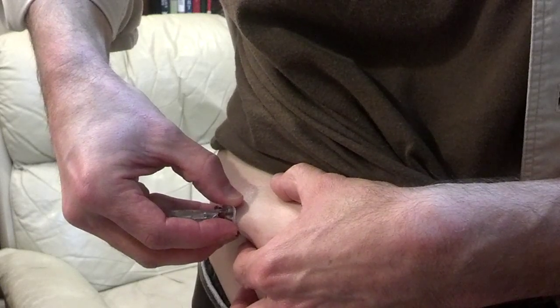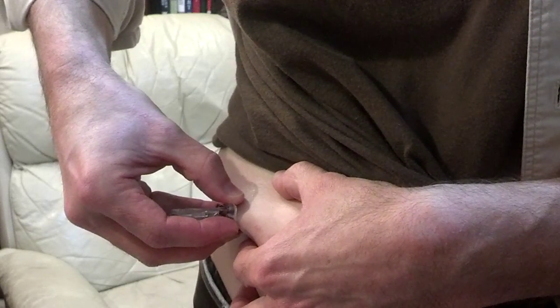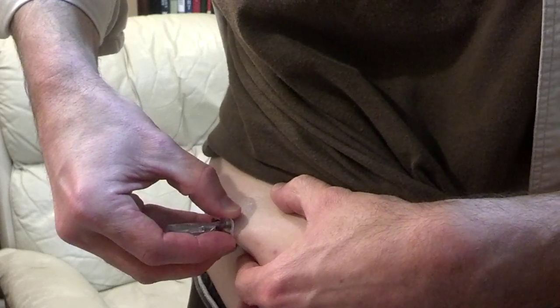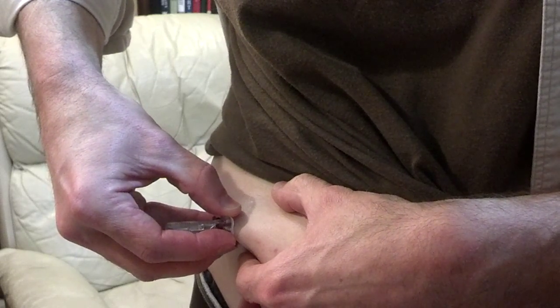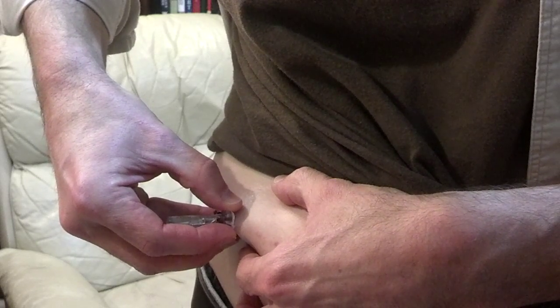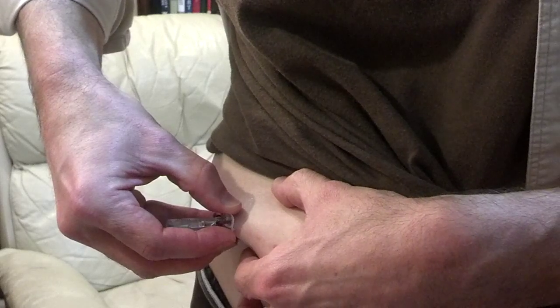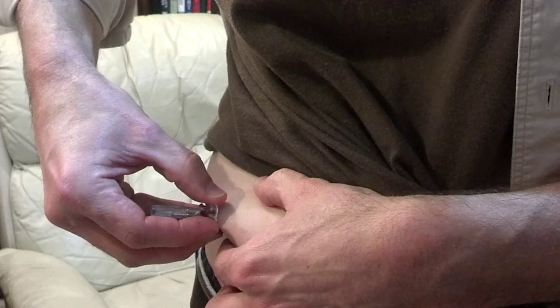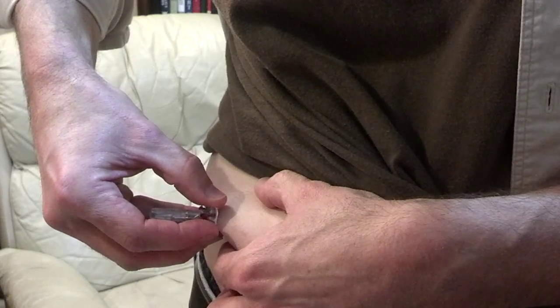It's not letting go easily. I can feel it peeling loose.